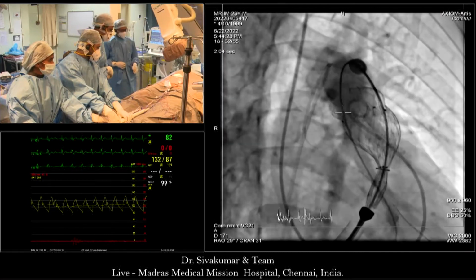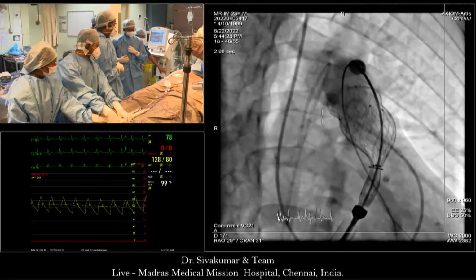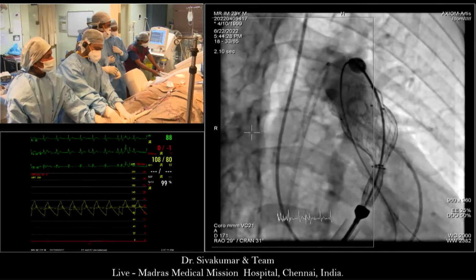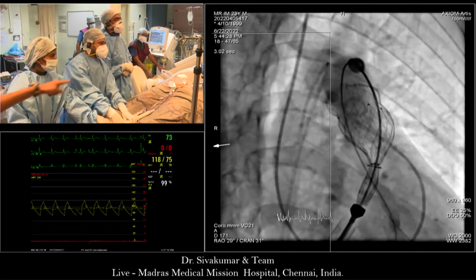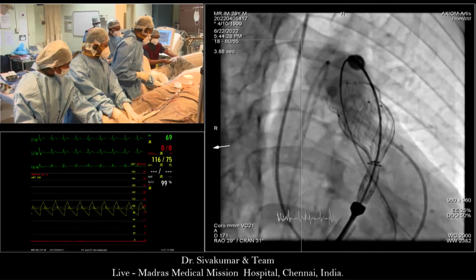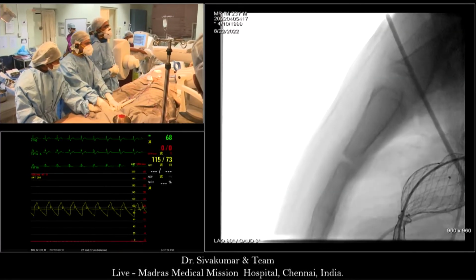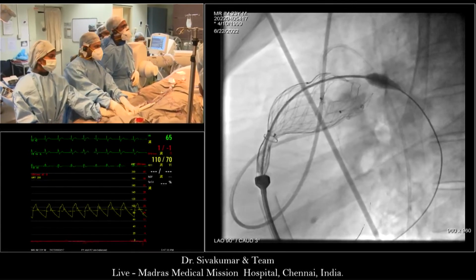This is something that Shiva never does. Mario, the difference between many of the labs in the West and the labs in India is that we have monoplane. So that is one of the reasons why we less often use lateral. It means a lot of movement. I think sometimes it can be quite difficult to appreciate the offset origin of the branches, and therefore I think it's of course necessary to bridge that one too.